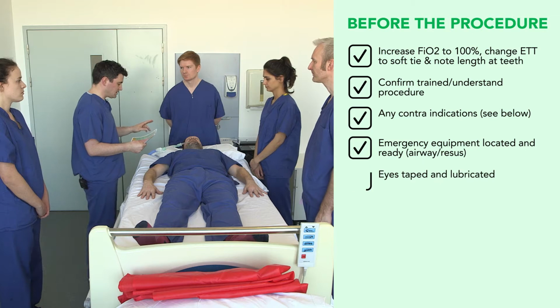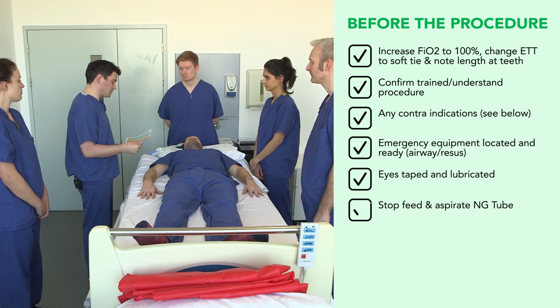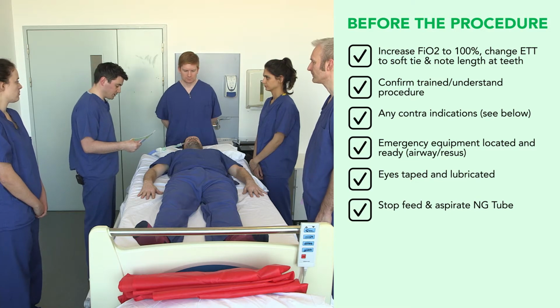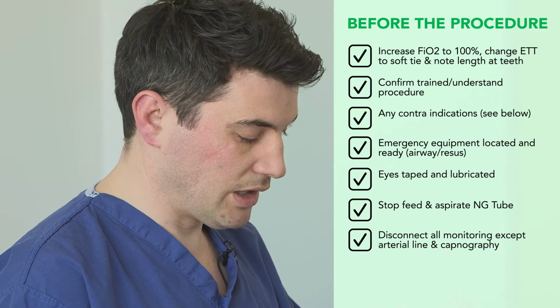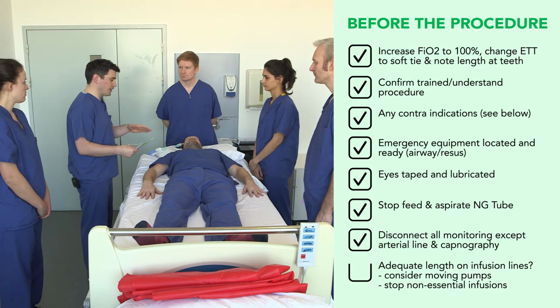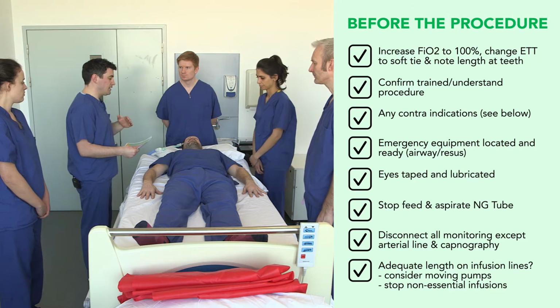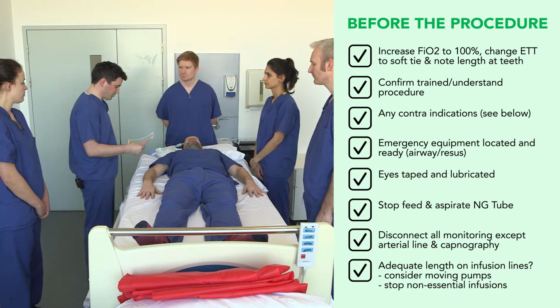The patient's eyes are taped and lubricated. The NG feed has been stopped, and the NG tube has been aspirated. We've disconnected all monitoring apart from arterial line and capnography. And we've established there's adequate length on the infusions. Any non-essential infusions have been stopped, and the lines have been positioned appropriately.